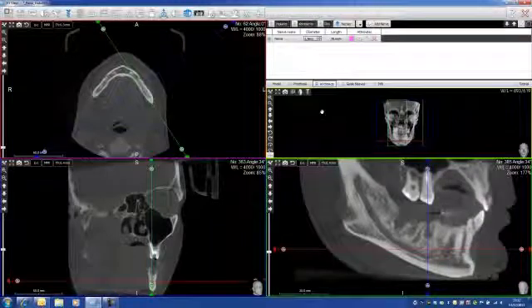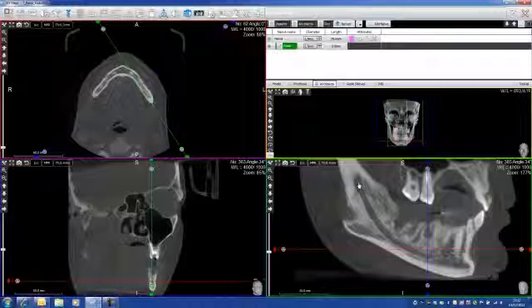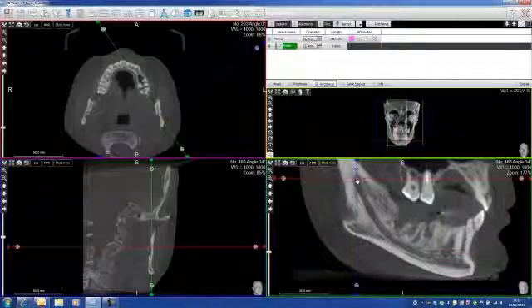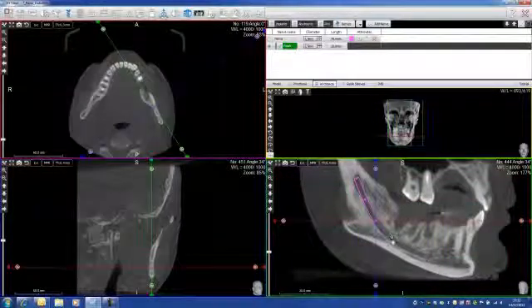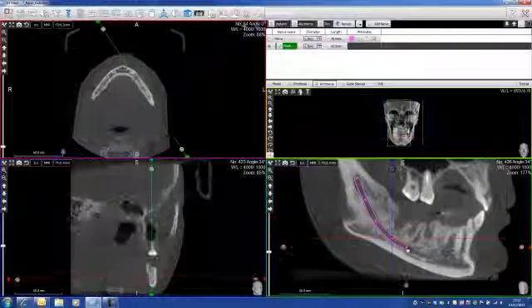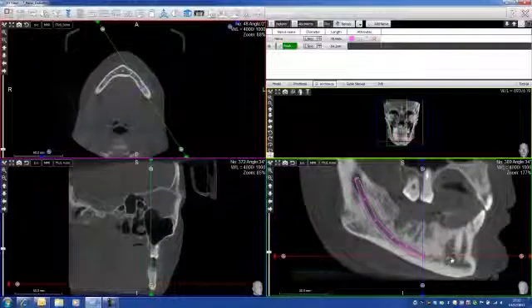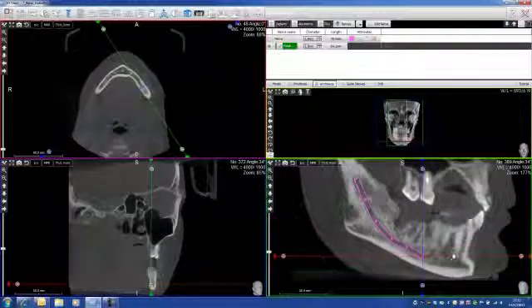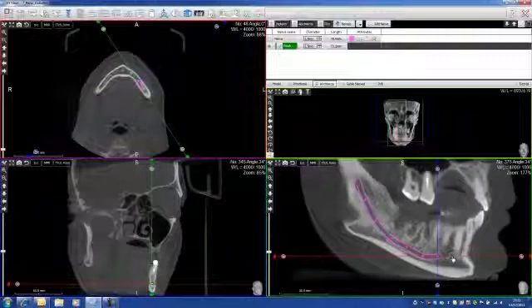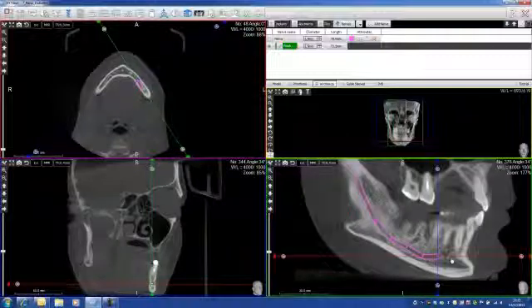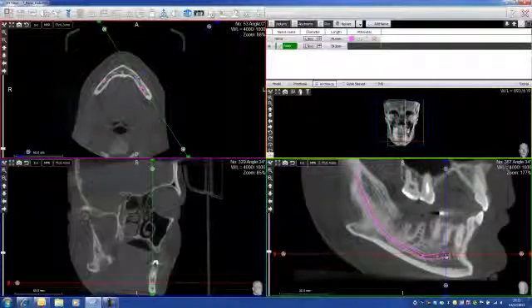Okay, and I'll do exactly the same process: Add Nerve, left click, one point, second point, and then I can keep going down. There we go. I roll a little bit. There we go. I see the end of it. Click here, and then on the foramen here. And I press Finish.